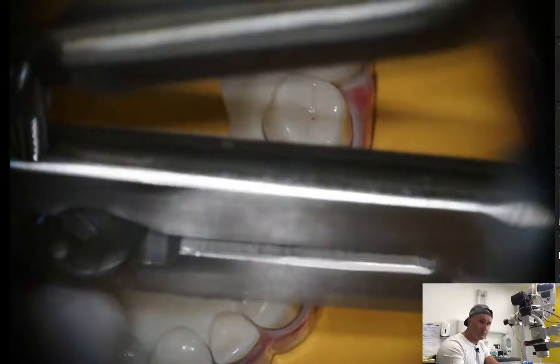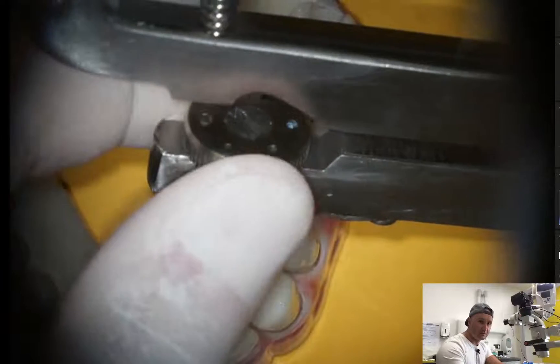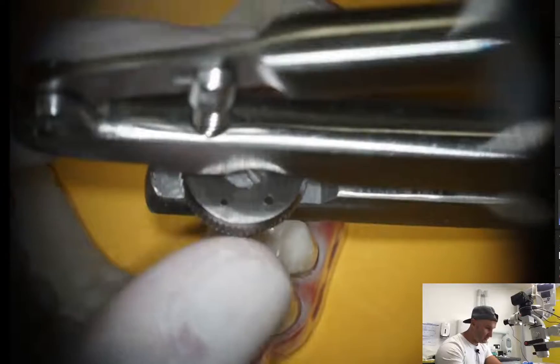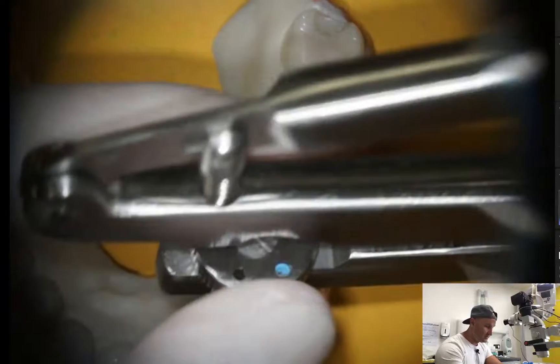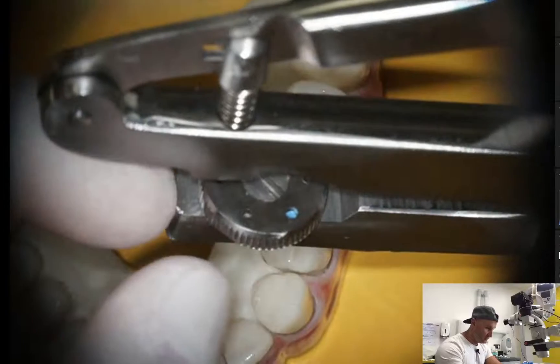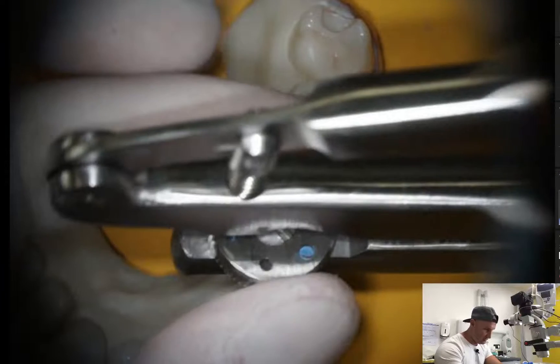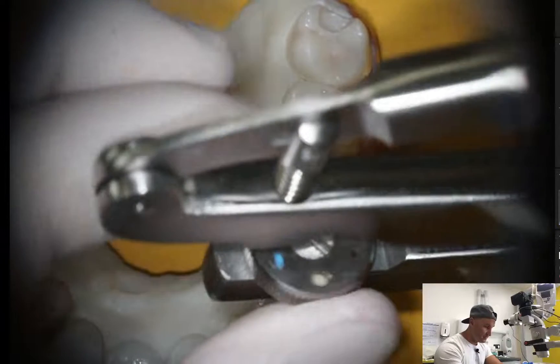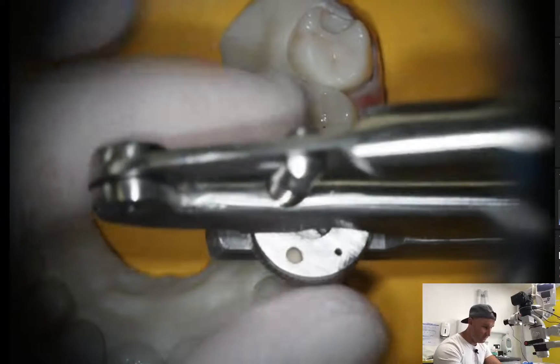Looking at the punch, it has different sizes of holes which you can switch by rotating this wheel. The biggest and the next smaller are for molars, the next two are for premolars, and the last two — the smallest — are for incisors. The smallest one is for lower incisors, the bigger of those two for upper incisors. Sometimes the premolar size works better for incisors as well. So we choose the second-largest hole to make our punch.